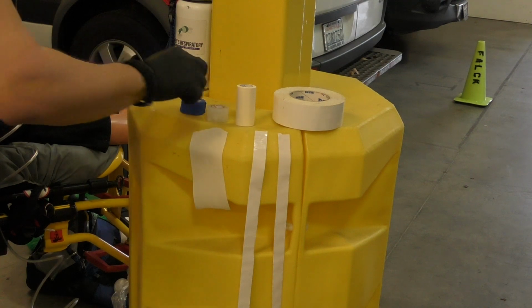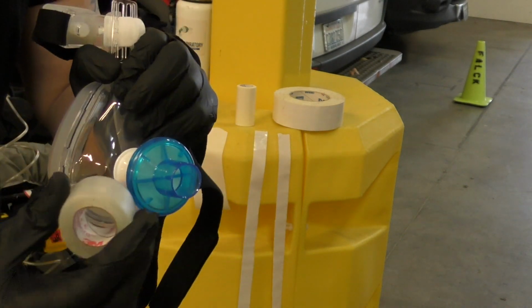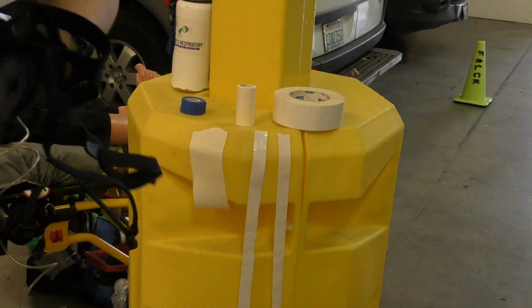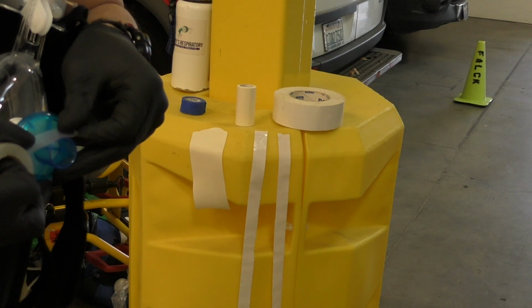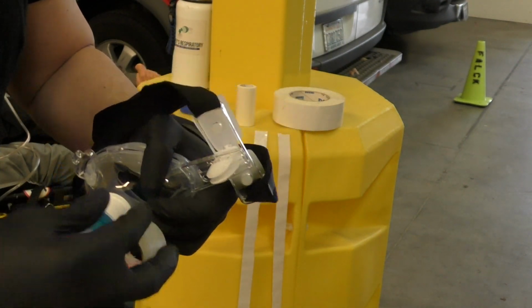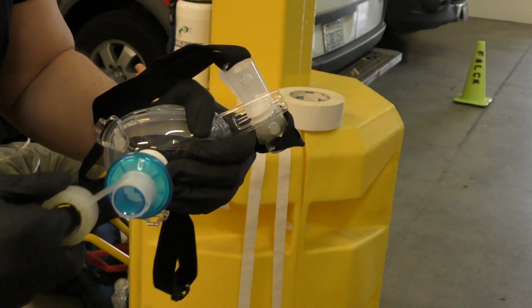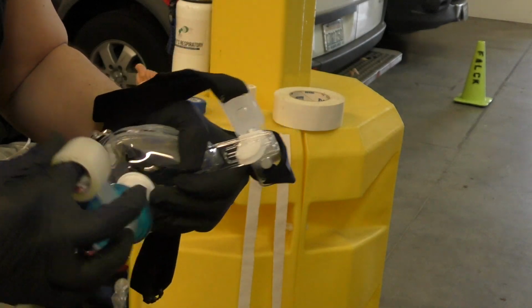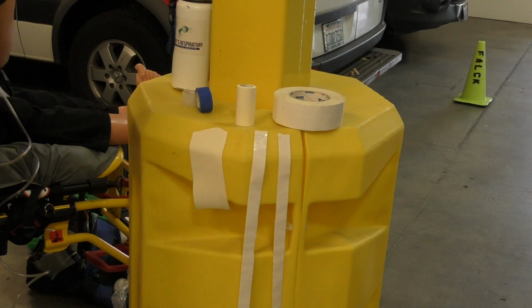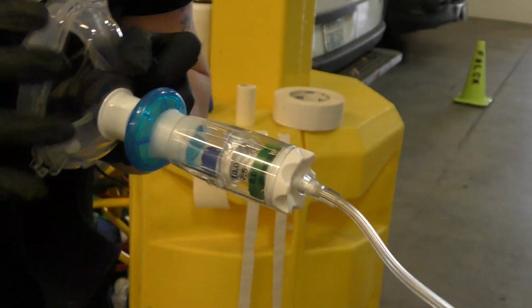So let's first start with this tape, which is probably the most common tape everyone has on them. We want to make this fit. I pre-measured it out for you. I'm going to put this tape here, and we're going to go around 15 times. Ready? 1, 2, 3, 4. It doesn't have to be perfect. 5, 6, 7, 8, 9, 10, 11, 12, 13, 14, 15, there we go. So now this should fit snugly on there. There we go, okay? So now we have our filter in line.